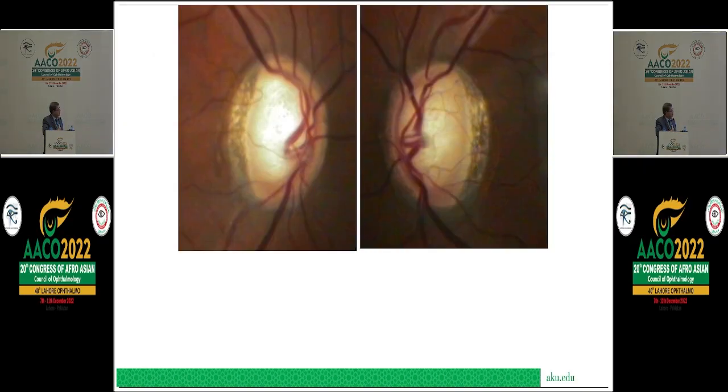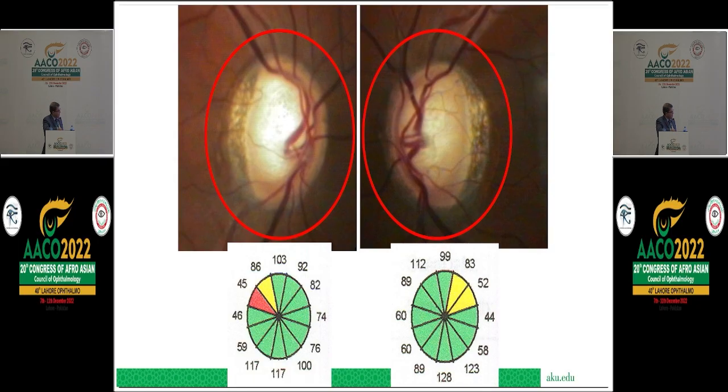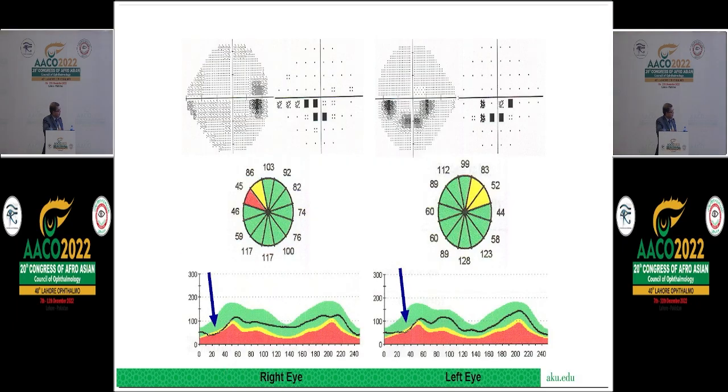Okay, so now structure-function correlation. Here are large discs again. Is this normal, abnormal? Putting on your optic nerve hat, you would say there is some abnormality, showing some thinning over here, but also here clinically. The visual field shows inferior depression, paracentral depression, maybe partial arcuate, which correlates with the supratemporal loss, right? And when you look at the TSNIT plot, there is depression here supratemporally in the right and left eye. So there is structure-function correlation, which generally is a good thing.